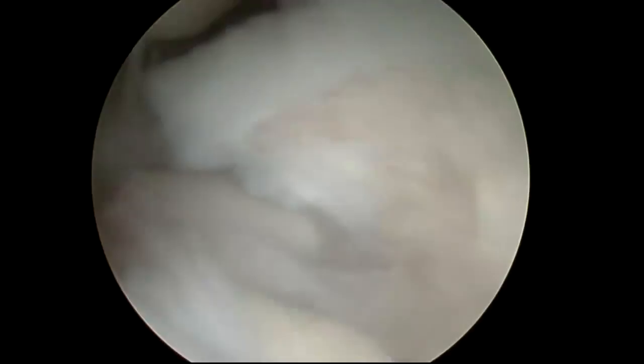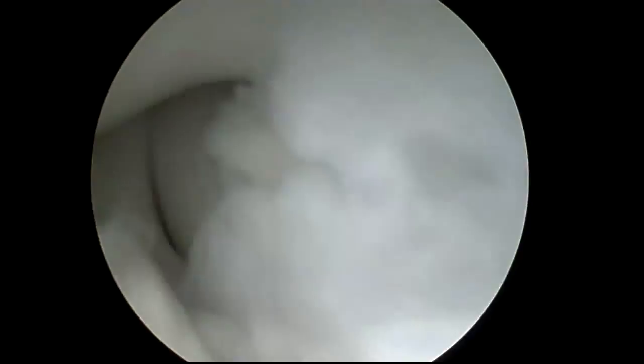Now we're in the back of the elbow. This is the plica — it's on the right side. You can see how it gets into the joint. It will create popping, pain, and snapping with joint motion. The radial head that it gets caught on is that circular structure below it.